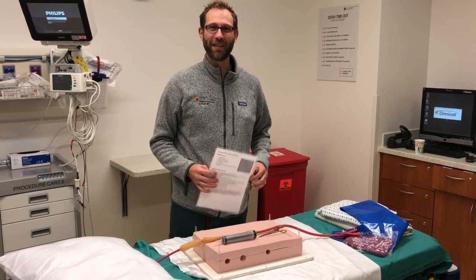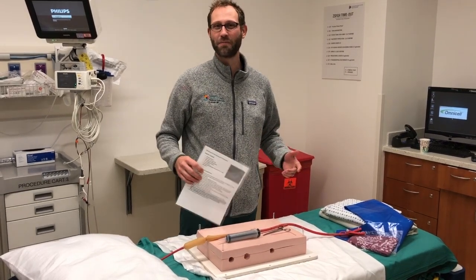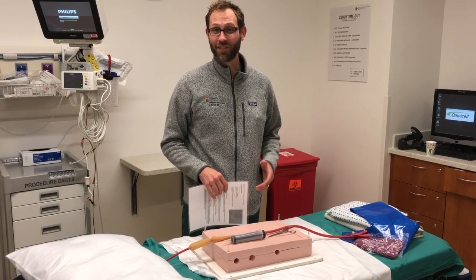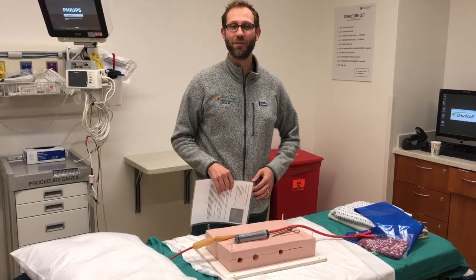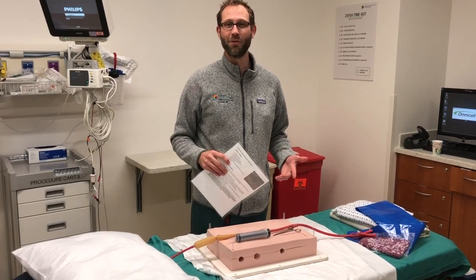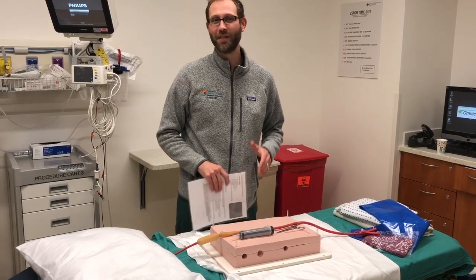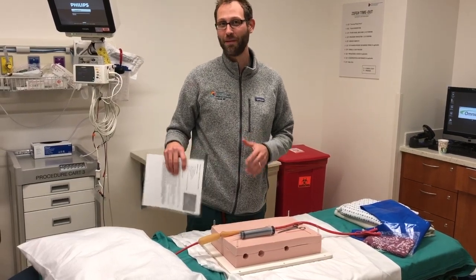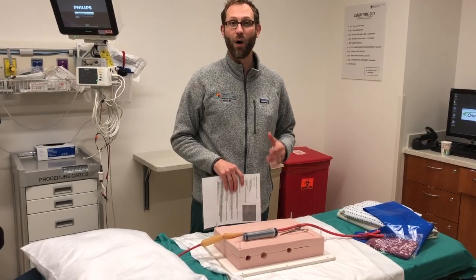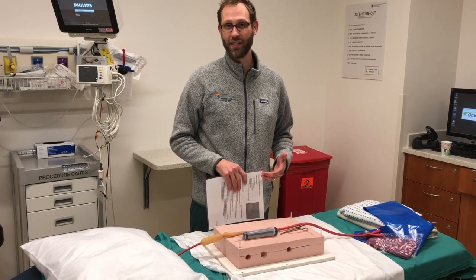Today I want to talk about placing a Minnesota tube. This is not something that happens all that often, but it's probably best for everyone involved to know how it works. The indication for placing a Minnesota tube is variceal bleeding that fails endoscopy, or someone who's bleeding so much you don't think they'll make it to endoscopy. However, it's very important to note that the Minnesota tube is a bridge to TIPS — it is not definitive therapy. It is a way to stabilize the patient while IR is getting ready to decompress the portal system.